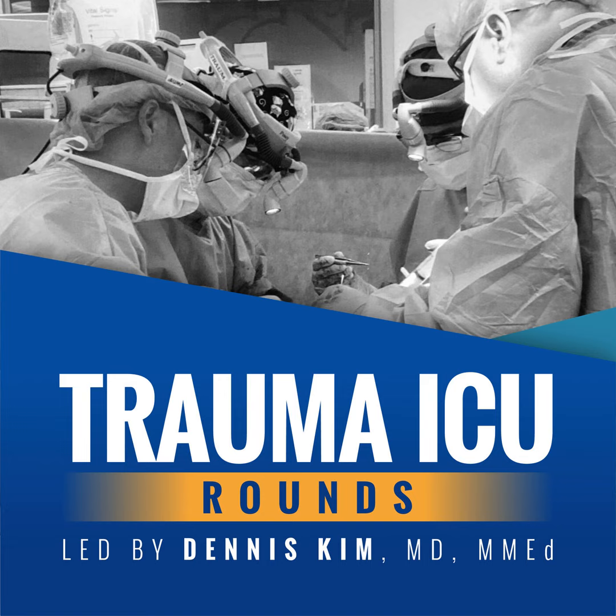Now, in terms of the optimal duration of an SBT, this typically ranges, as we've already discussed, anywhere from between 30 minutes to 120 minutes or 2 hours. And in general, an initial SBT of 30 minutes in duration is considered sufficient to determine whether the ventilator can be safely discontinued, and a prolonged SBT doesn't appear to be superior to a shorter SBT.